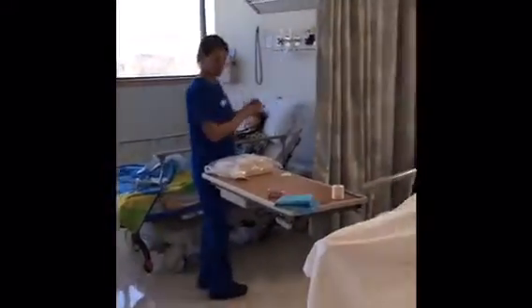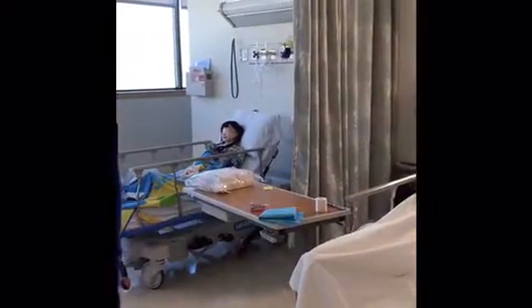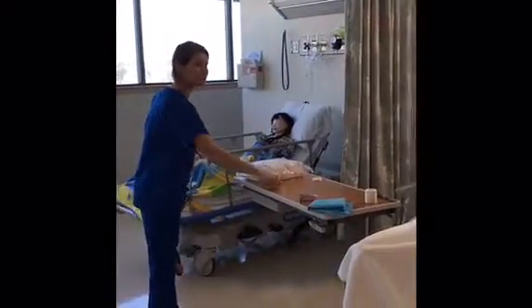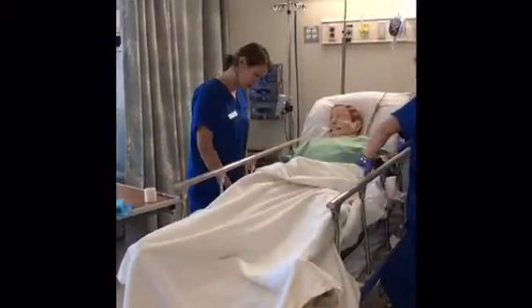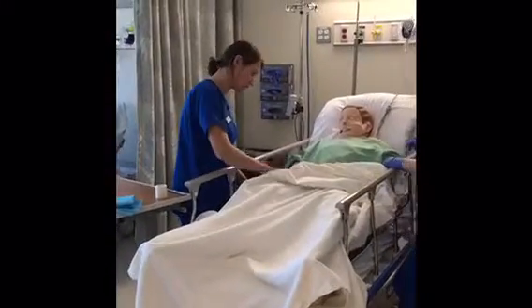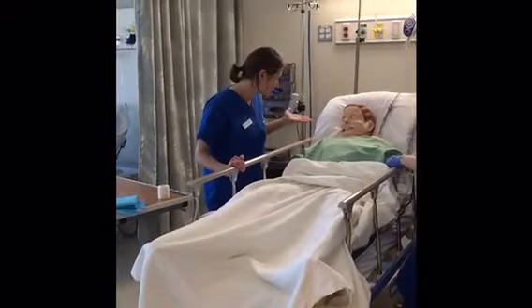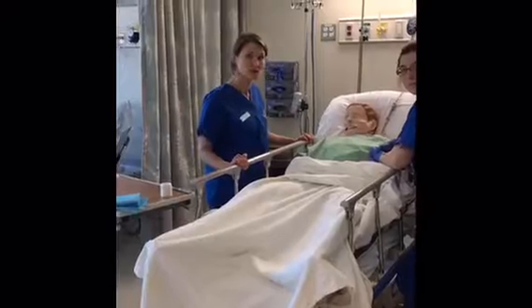I am then going to enter my patient's room. Going to knock, introduce myself, identify the patient with 2 identifiers. I am then going to explain the procedure and ask my patient if they have any allergies to latex, iodine.